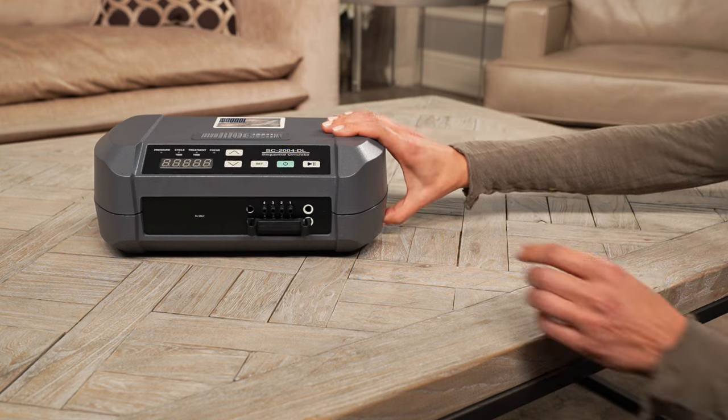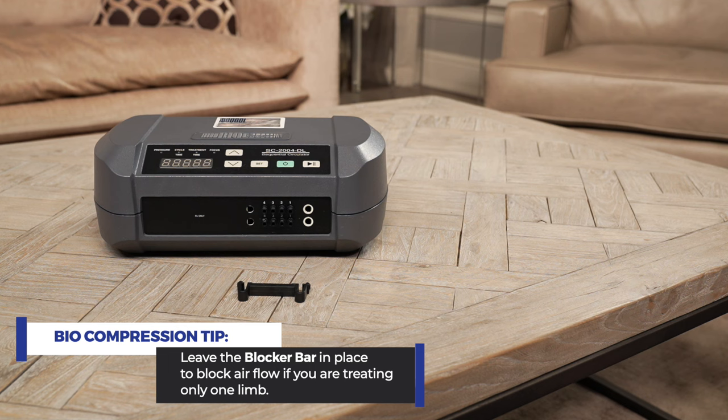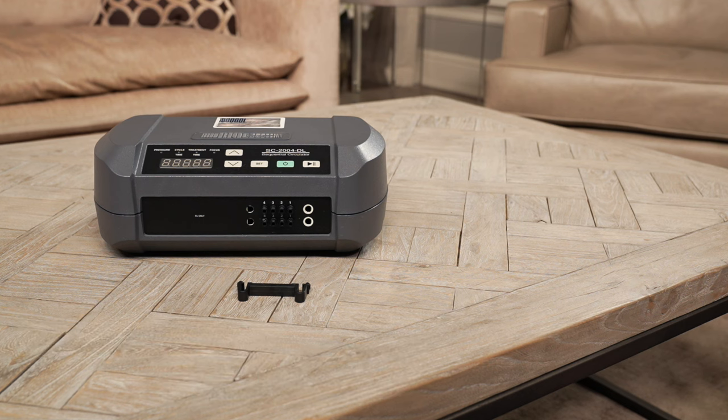Leave the blocker bar in place to block airflow if you are treating only one limb. If you are treating two limbs, you won't need the blocker bar, but you should store it safely for future use.